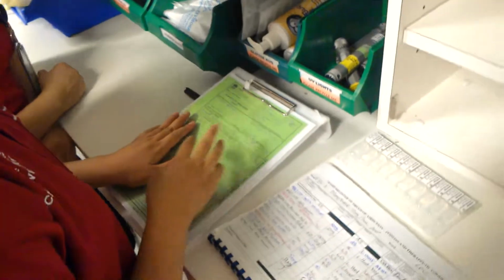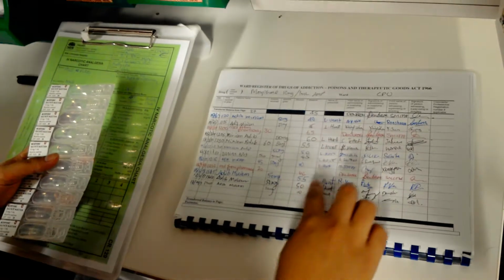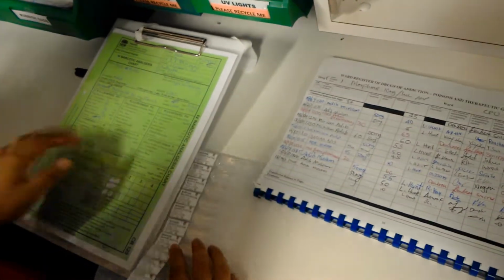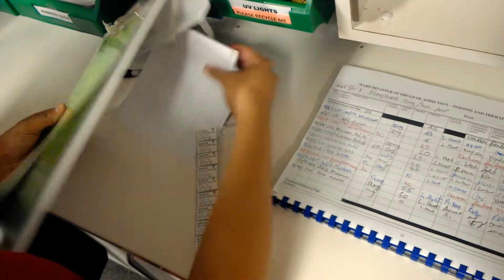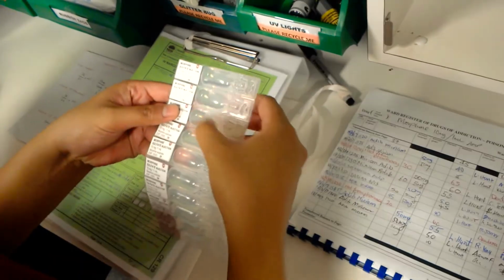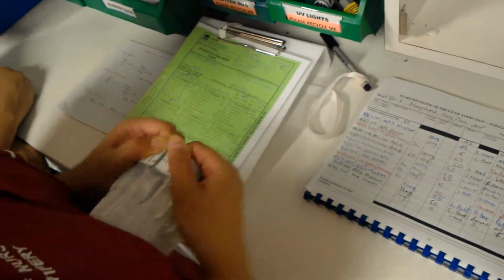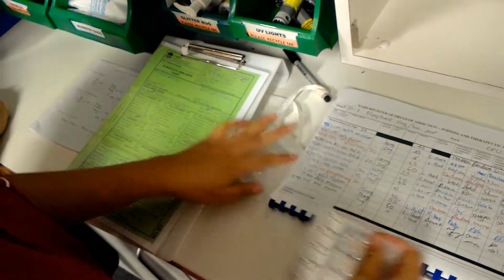Okay, so I'll be needing morphine for today for Miriam Adib. So I've got morphine now, and the last balance was 10, so there should be 10 in here. Okay. So I know from my calculations that I needed to get 5 vials of the morphine. So 1, 2, 3, 4, 5. Okay, I'll just do my check.